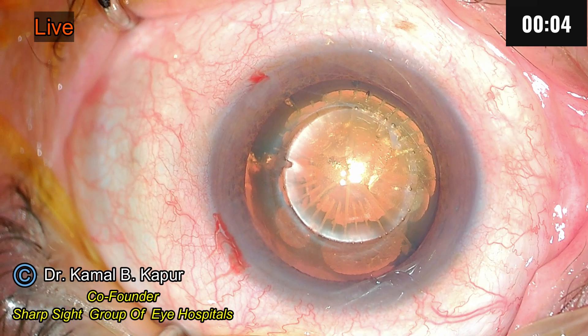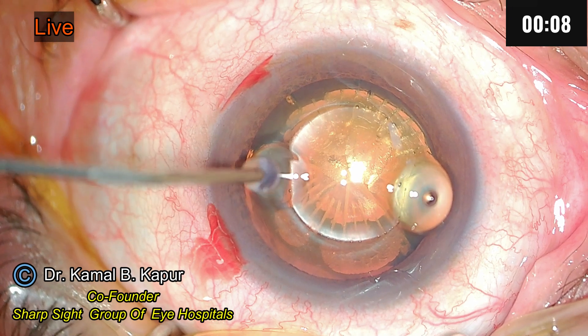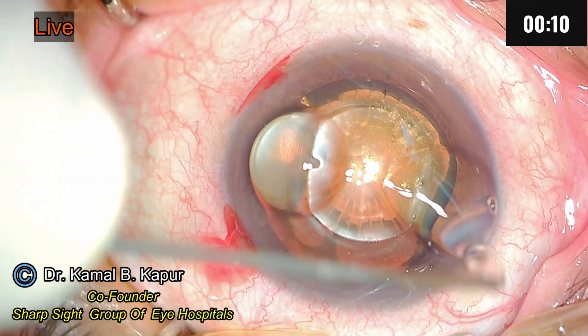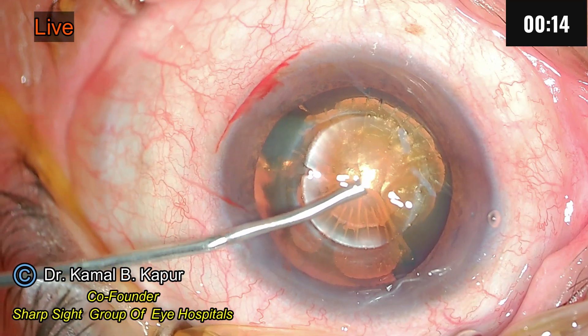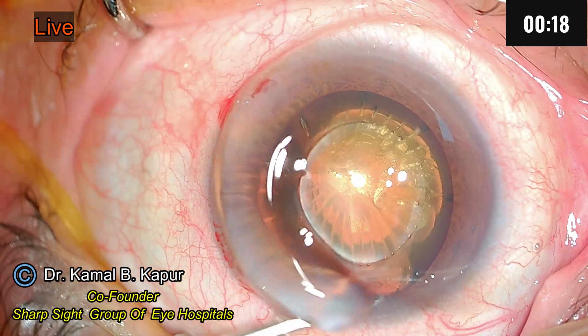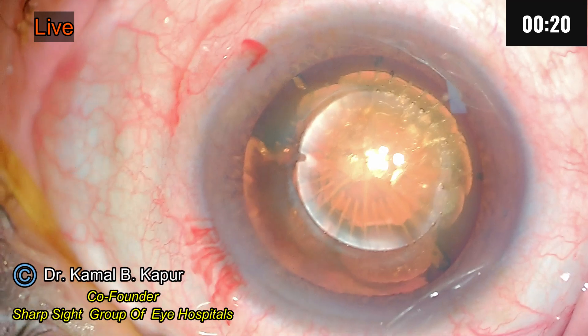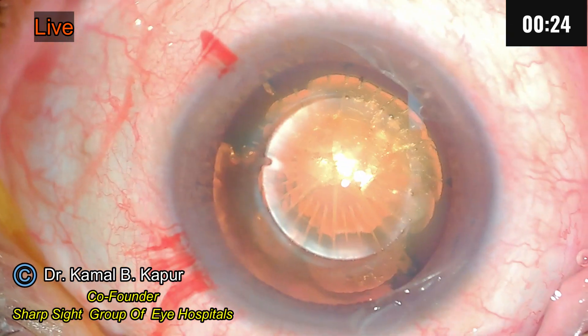I'm using a Lenzar machine. Now you can see these two nubs here on the capsular hexis margin — there's one here and one here. Now these are depicting the intended axis of IOL placement. These marks are made by the machine itself while doing the capsular hexis, and they are very very useful in identifying the placement of the toric lens.